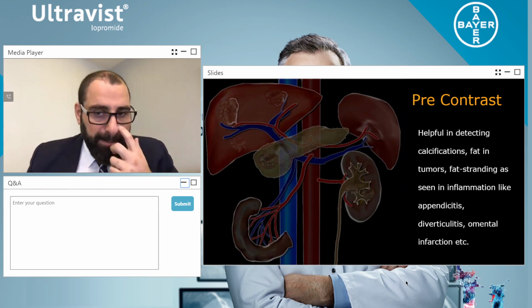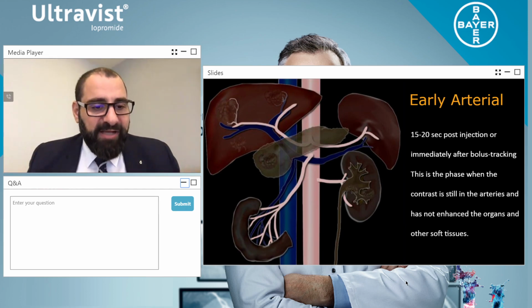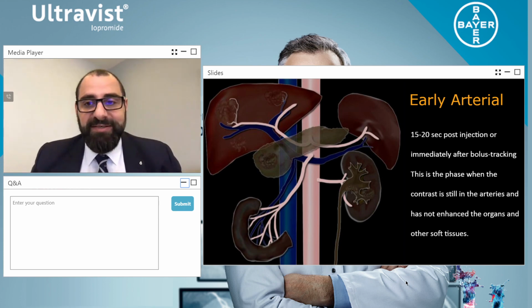So even if you reach the 180 Hounsfield unit density of the abdominal aorta, it's not going to enhance very quickly, because within 3 seconds you've scanned the liver. It's not going to enhance those lesions. That's why we need an interscan delay of 8 seconds for the contrast to get to the lesion. This is where it's important.